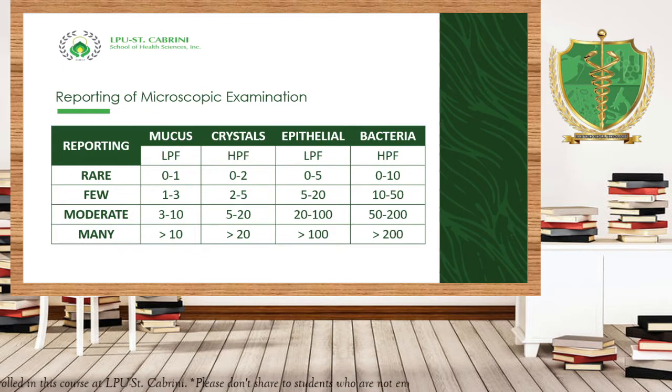Okay? So kapag po gumagamit pa ng occasional, medyo matanda na po yung references natin. Instead of saying occasional, then we have what we call rare. Okay? Rare, 0 to 1 for mucus. Okay, so please have a screenshot of this slide, and please remember this by heart. All right.